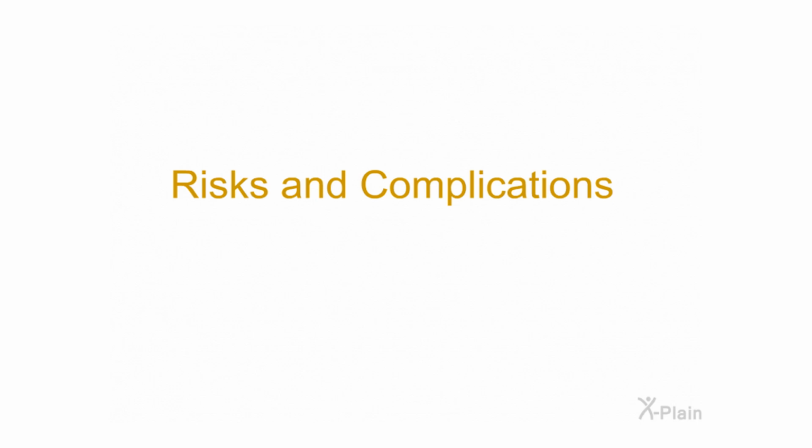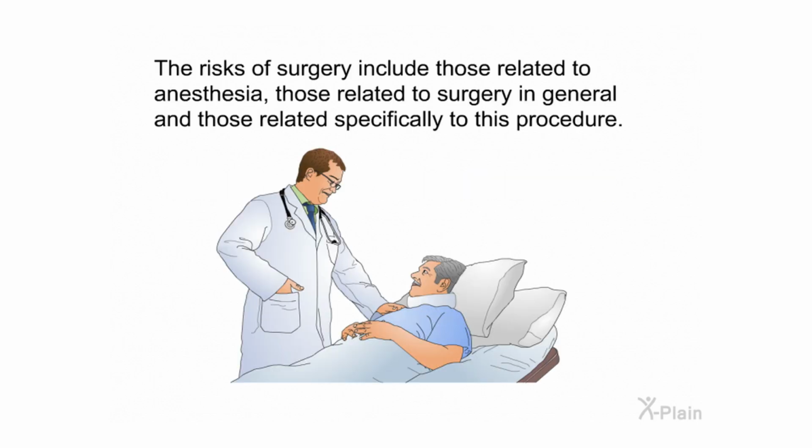Risks and complications. The risks of surgery include those related to anesthesia, those related to surgery in general, and those related specifically to this procedure.